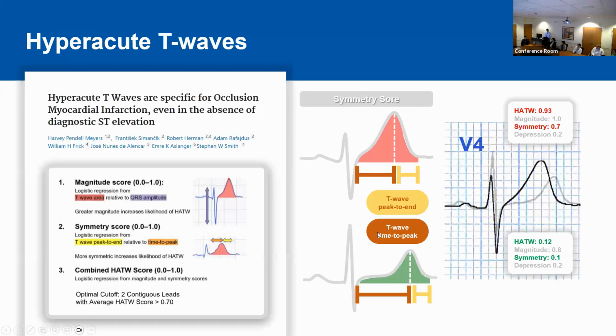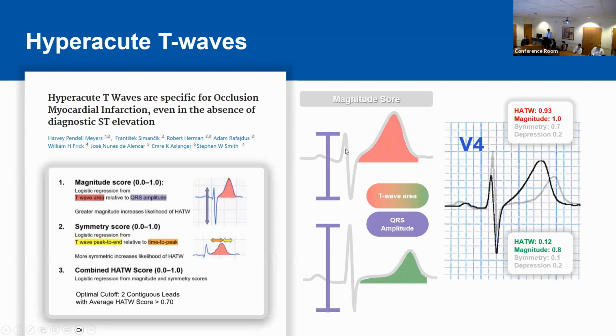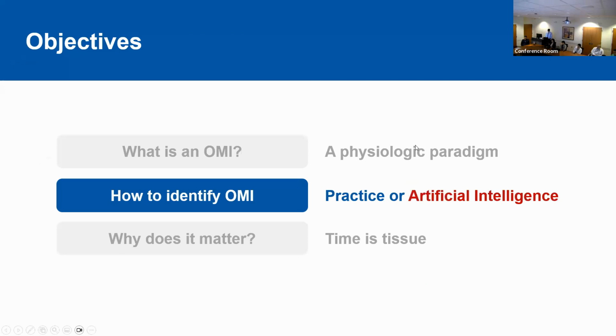When you say the preceding, do you mean comparing V3 to V4? Oh no, just the QRS complex, you compare it to the T wave, yeah.